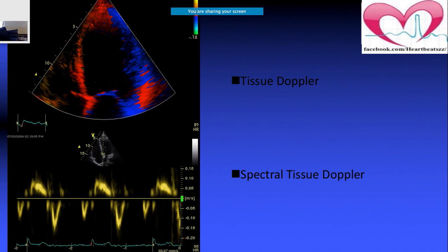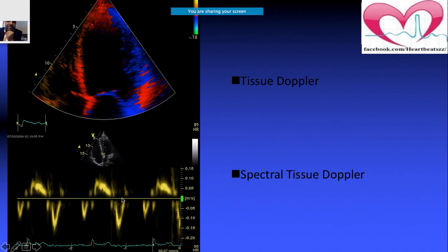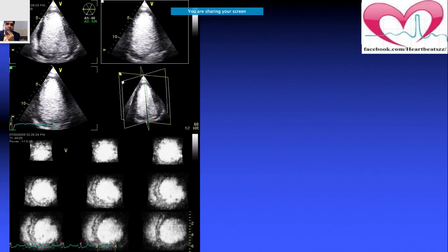This is what is called tissue Doppler and spectral tissue Doppler. These are very important imaging modalities beyond the traditional 2D or 3D echo, and we will be seeing more applications of this.